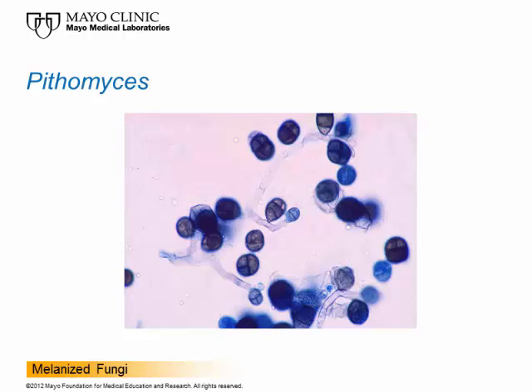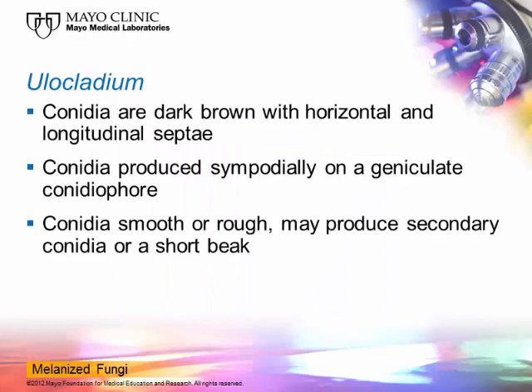The next organism is Ulocladium, which produces dark brown conidia with horizontal and longitudinal septations. The conidia are produced sympodially, meaning they're produced on one side and then the other of a conidiophore. As the conidiophore grows, it bends to one side or the other, and the conidia are produced on those bends. This type of conidiophore is called a geniculate conidiophore — it's like a series of bent knees.